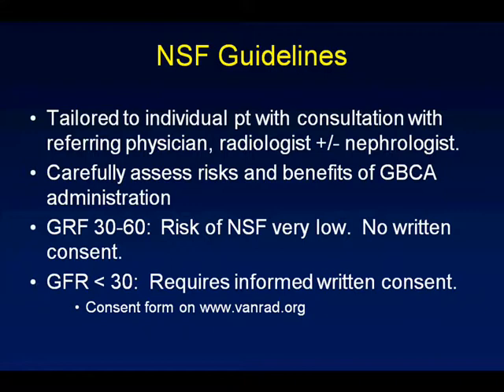For patients with severe renal impairment, grade 4 and 5, GFR of less than 30, if we feel that gadolinium is necessary for the examination, we require informed written consent. For those of you who want to look at the actual consent form, it's on our website, www.vanrad.org. You can download or print out that consent form. It's nice to give it to the patient ahead of time so they have time to think about whether they want to undergo this procedure.